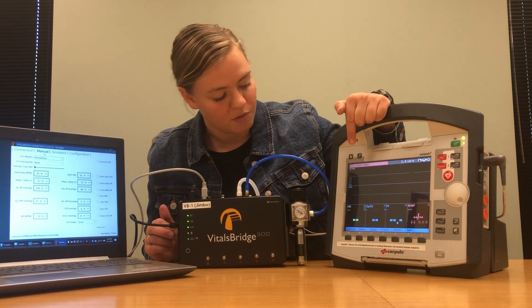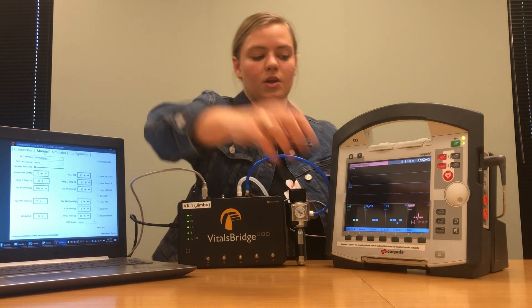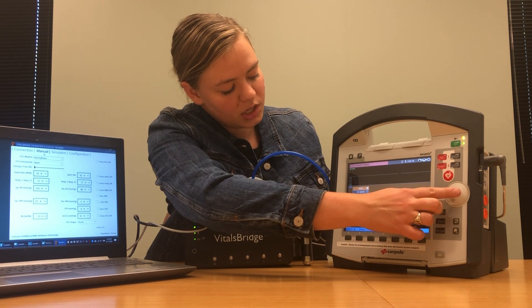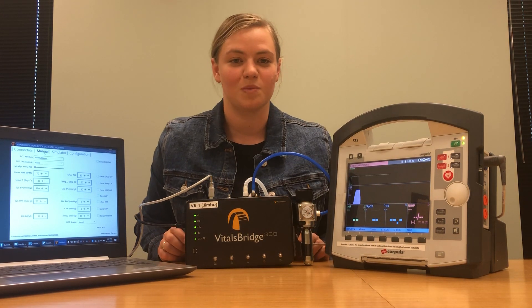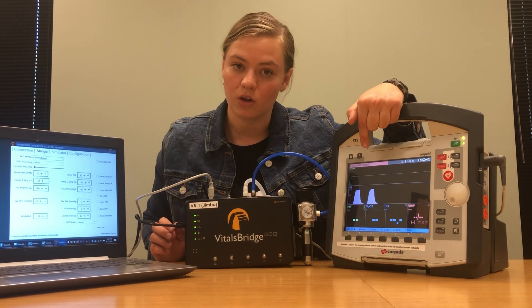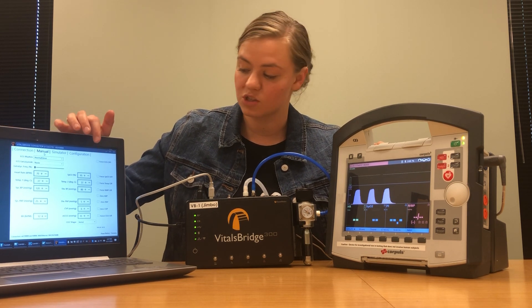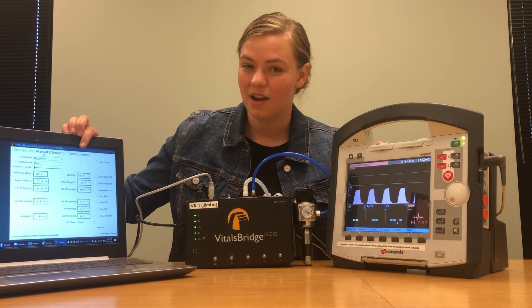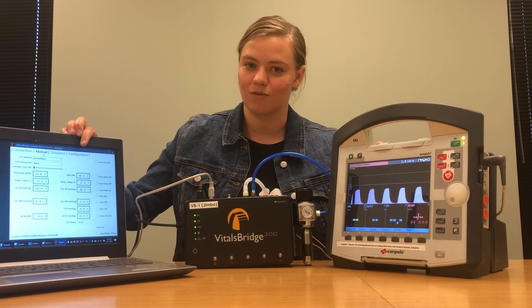Once it's screwed in tight, if you have carbon dioxide on, you should shortly begin to see a CO2 waveform. If you're not seeing a CO2 waveform, it's likely that your patient monitor is set to show an SPO2 waveform — that's easy to fix. Just come down to that section, select it, and change it to show CO2, and you should see those nice good breaths. If your CO2 waves are too high or too low compared to what you've entered in your VitalsBridge connector software, go to the configuration tab and perform a calibration. Instructions on how to perform calibrations can be found on vitalsbridge.com.